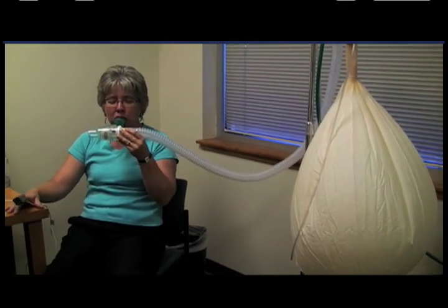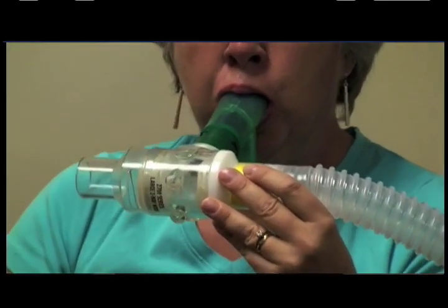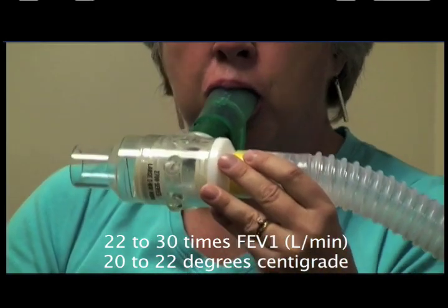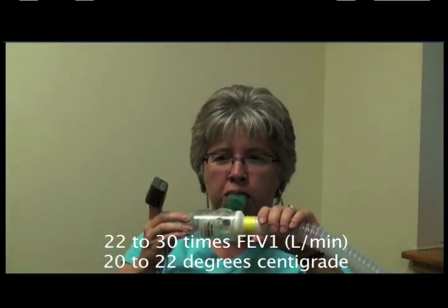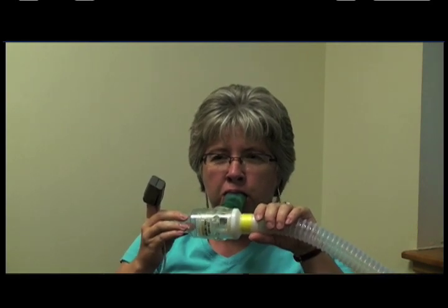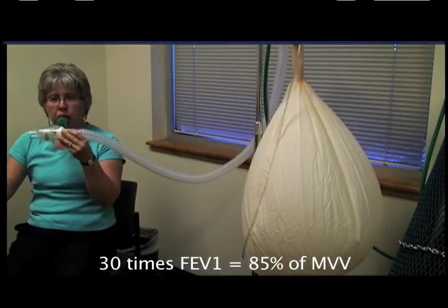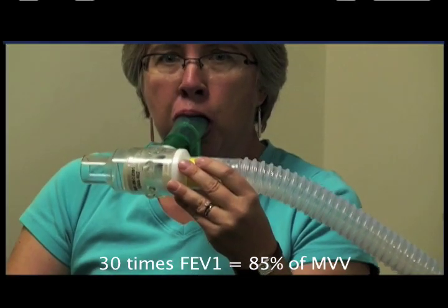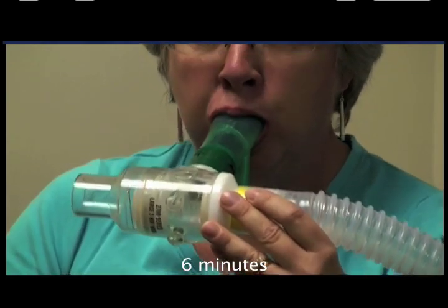Once the pre-challenge spirometry is completed and the data reviewed, then the challenge may begin. The patient inhales the gas mixture maximally with a target ventilation rate of between 22 and 30 times the baseline FEV1 in liters per minute. Air is usually maintained at between 20 and 22 degrees centigrade. Pulse oximetry is simultaneously performed with the challenge. At 30 times the baseline FEV1, the patient will be breathing at about 85% of maximum voluntary ventilation, or MVV. The maximum inhalation continues for a total of about 6 minutes.